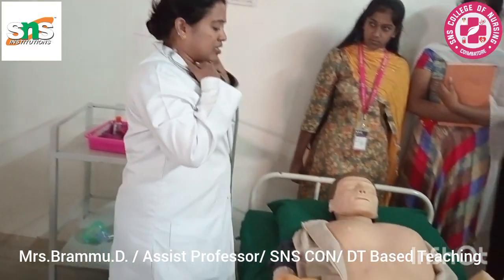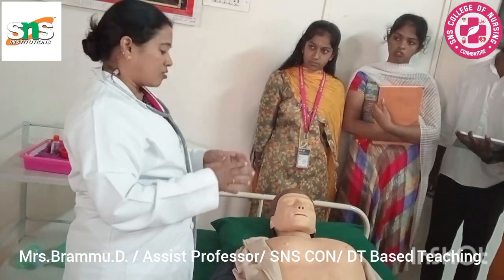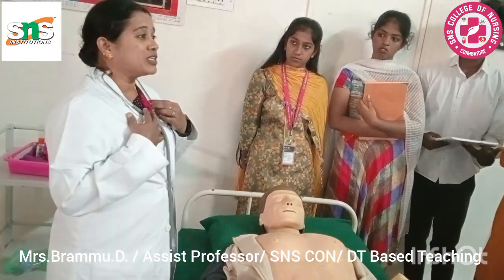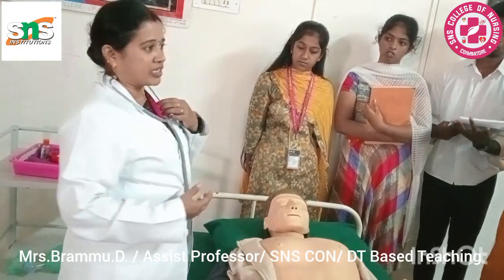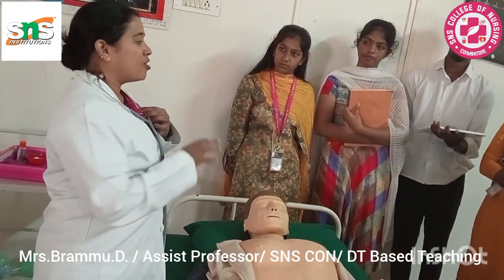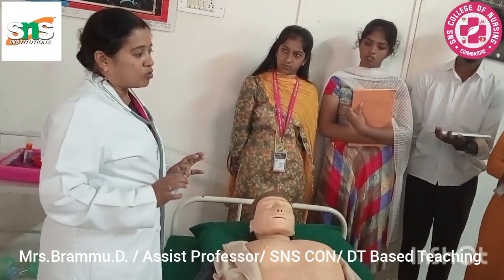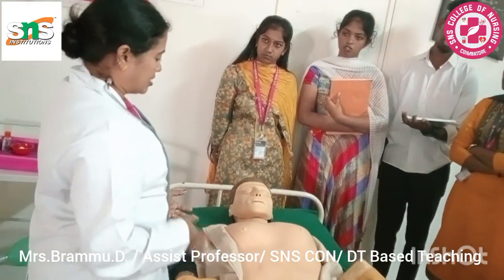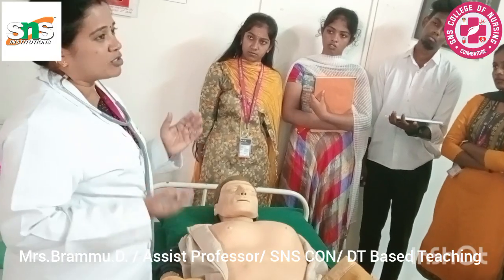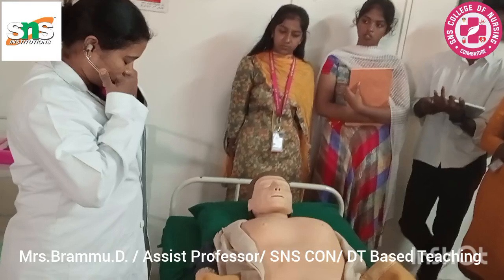After that, explain to the patient that I am going to do the procedure, and do not cough or do any other adventitious breathing. Otherwise the patient will think, oh, the healthcare worker is checking, so let me hold the breath, let me relax, or let me do fast breathing. All that should not be done. They have to be as usual as they can. Mostly according to the book, if the patient is able to sit, always auscultate the heart sounds in a sitting position. As this is a dummy, we are doing it in the lying down position.